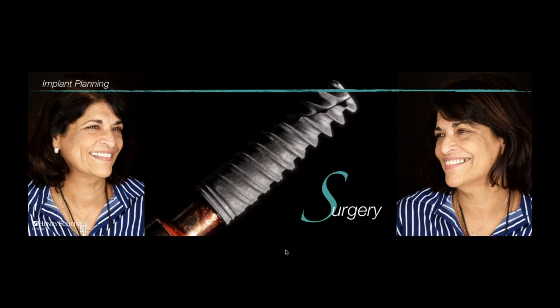You can place the implant, and you know and trust that you're going to get good restorative outcomes because we utilized the entire digital workflow. We took intraoral scanning to get our initial data of what's going on inside the mouth with the hard and soft tissues. We took good CBCT technology to get our accurate representation of where the underlying bone is. We merged that and used that information throughout a complete digital workflow to get predictable outcomes and gain efficiencies.